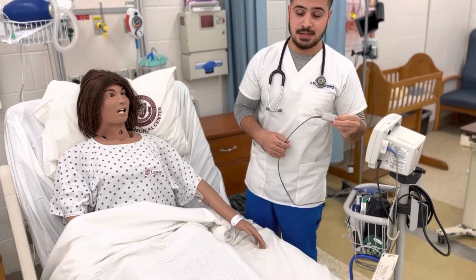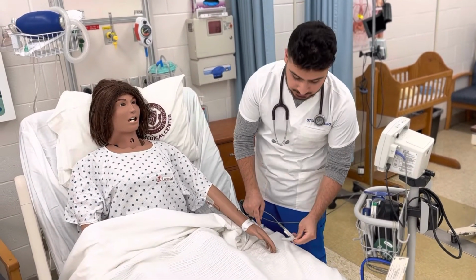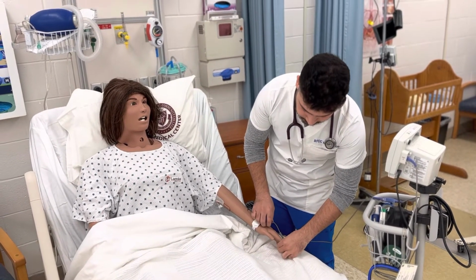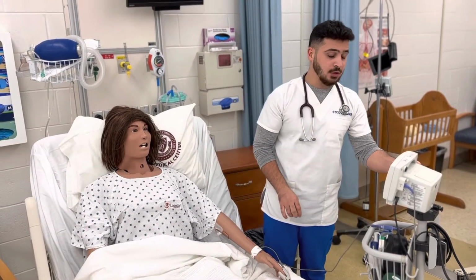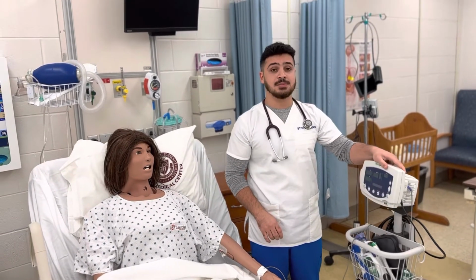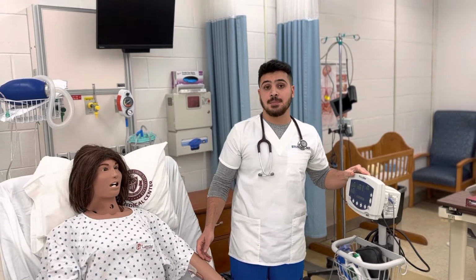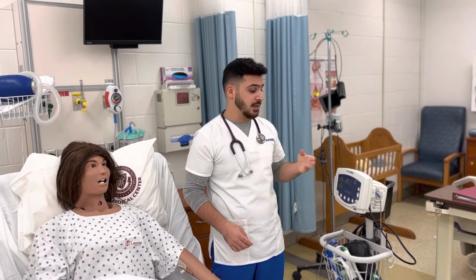We're going to place the oxygen saturation sensor on the patient's finger. The normal range for oxygen saturation is between 95 and 100, but we know that the patient has a respiratory issue, so we expect it to be low.